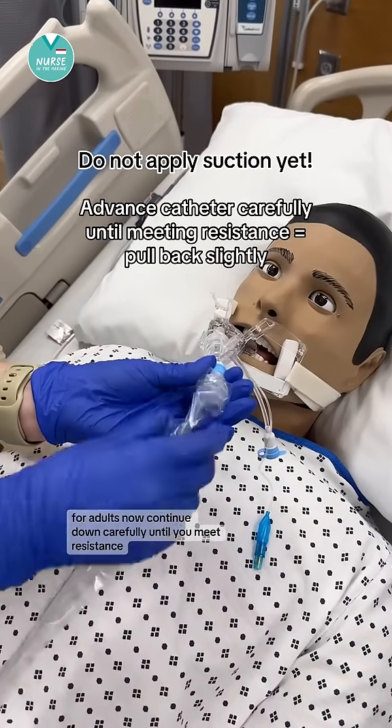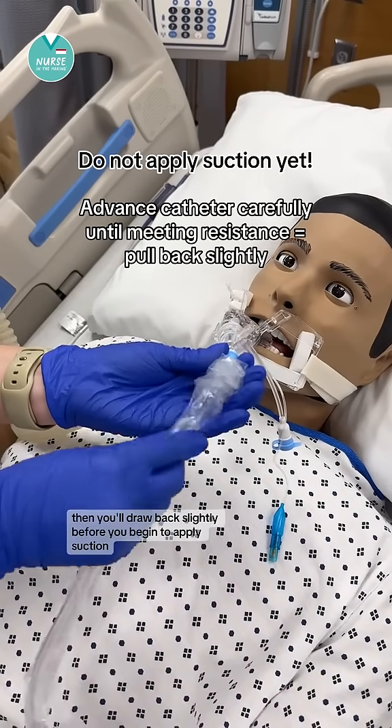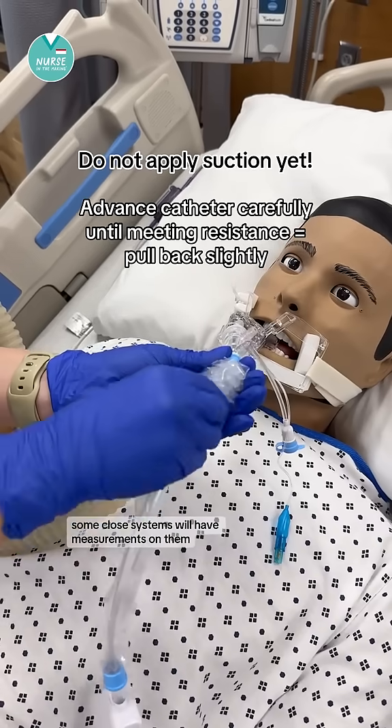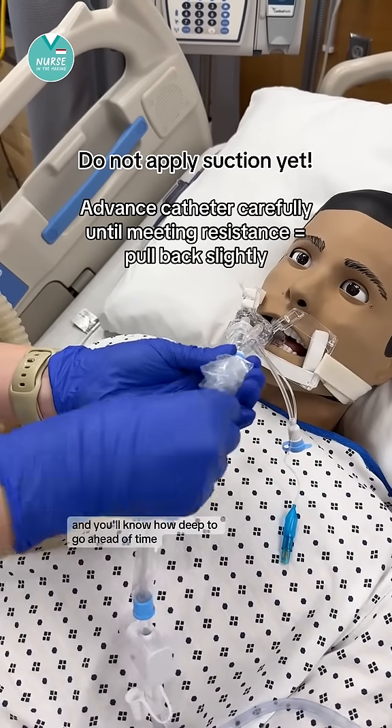Continue down carefully until you meet resistance, then draw back slightly before you begin to apply suction. Some closed systems will have measurements on them and you'll know how deep to go ahead of time.